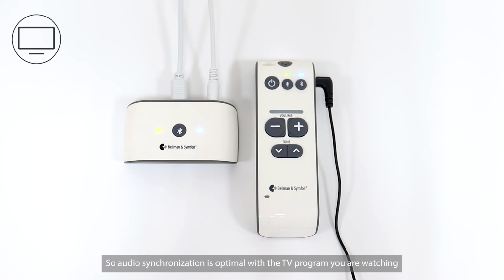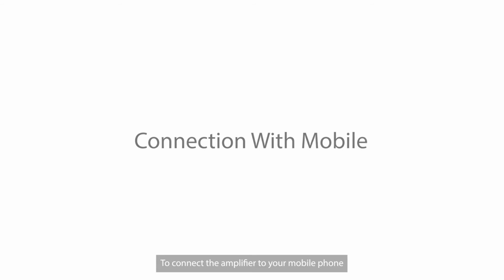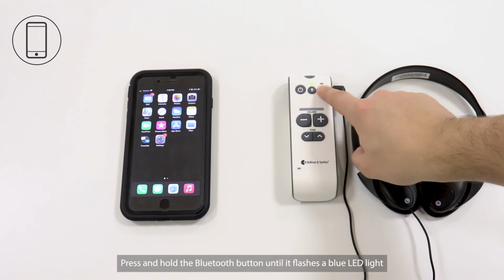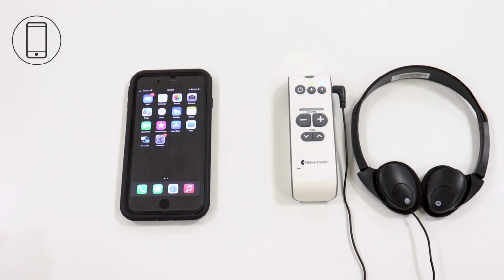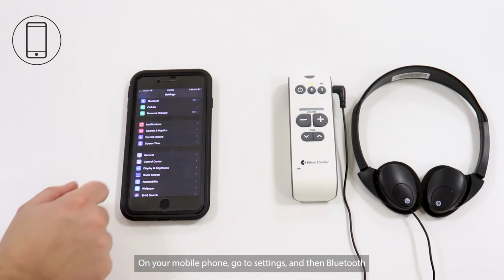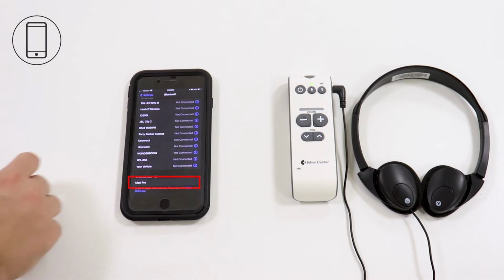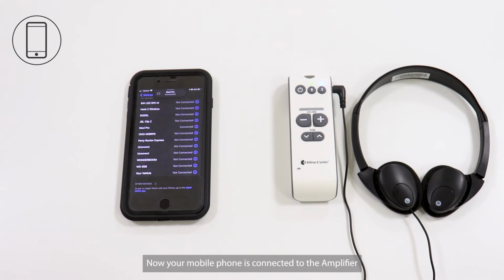To connect the amplifier to your mobile phone, press and hold the Bluetooth button until it flashes a blue LED light. On your mobile phone, go to Settings and then Bluetooth. Turn Bluetooth on and select Maxi Pro. Now your mobile phone is connected to the amplifier.